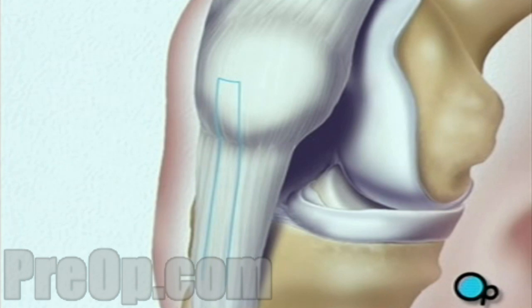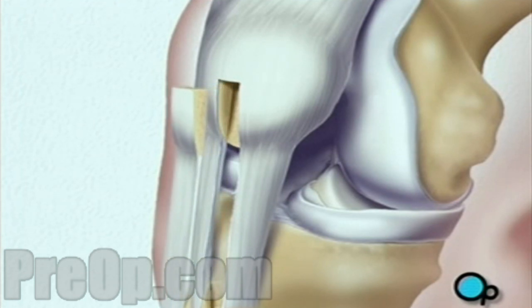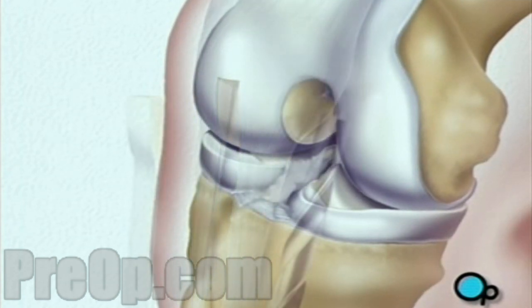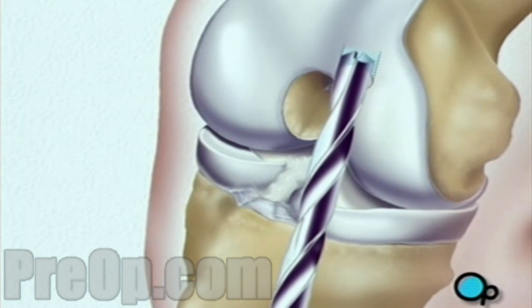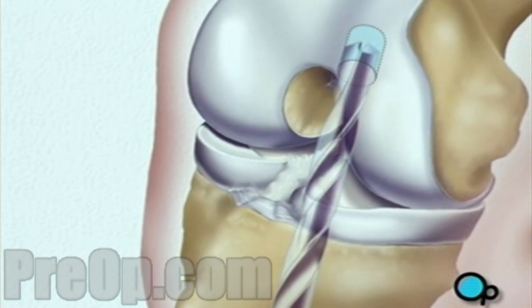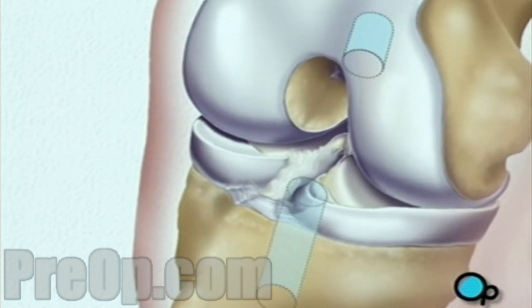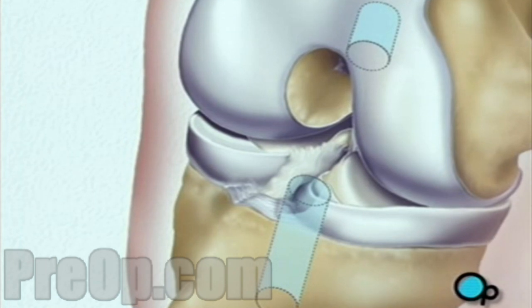This tissue or graft has bone on both ends and a section of tendon stretched between. Next, the team drills a hole in the end of the thigh bone and another in the top of the shin. These holes become the sockets for the bony ends of the tendon graft taken at the beginning of the procedure.